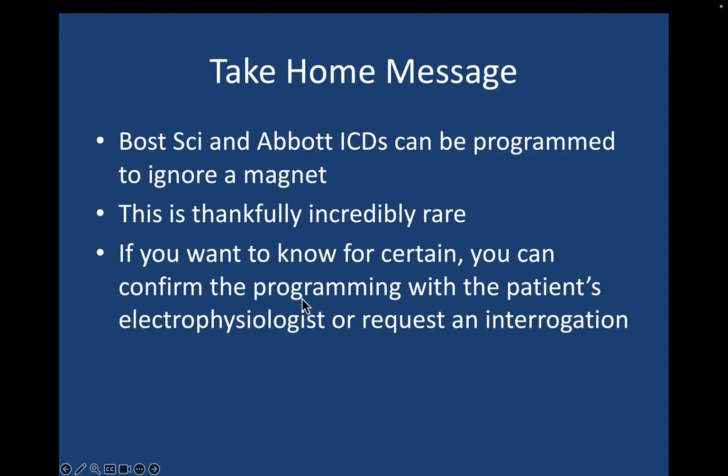So, take-home message, Boston Scientific and Abbott ICDs can be programmed to ignore a magnet. Thankfully, this is incredibly rare, but if you want to know for certain, you can confirm the programming with the patient's electrophysiologist or request an interrogation.